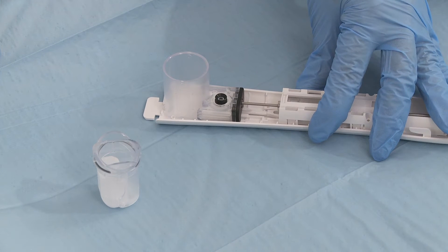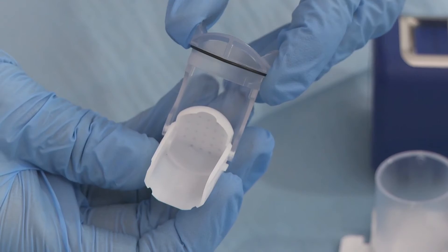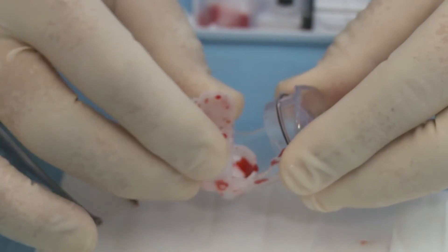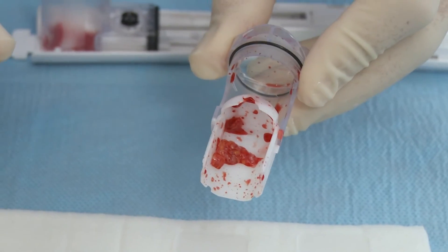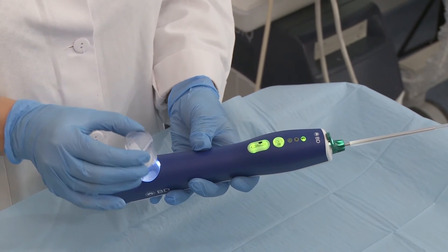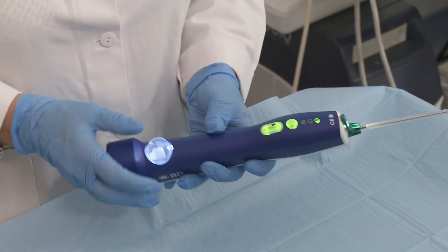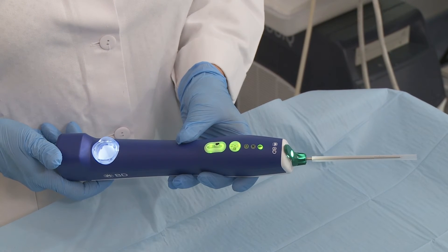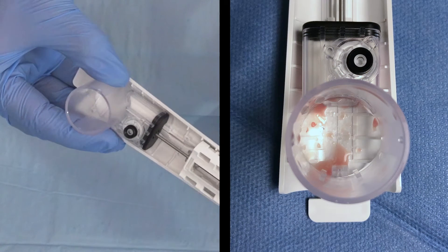The sample container opens by lightly pressing the sides inward and hinging it open. Remove the tissue samples from the sample container. If additional samples are required, replace the sample container into the device by turning clockwise to lock it into place. Ensure the sample container is secure before acquiring additional samples, and check for remaining samples in the sample container.